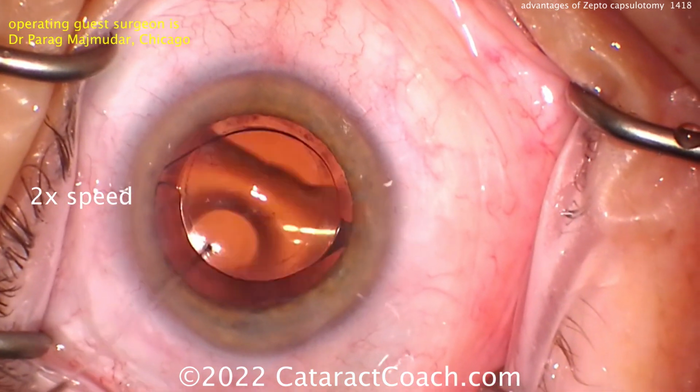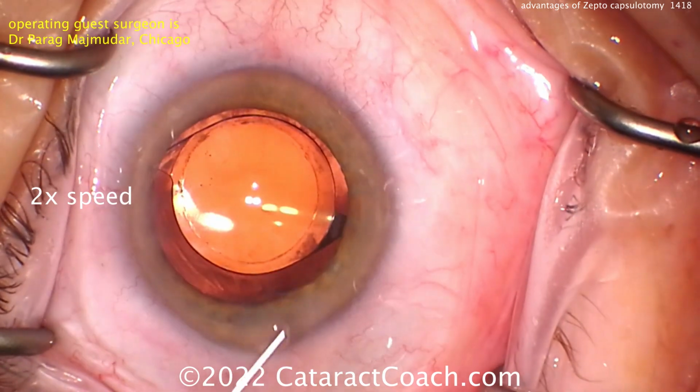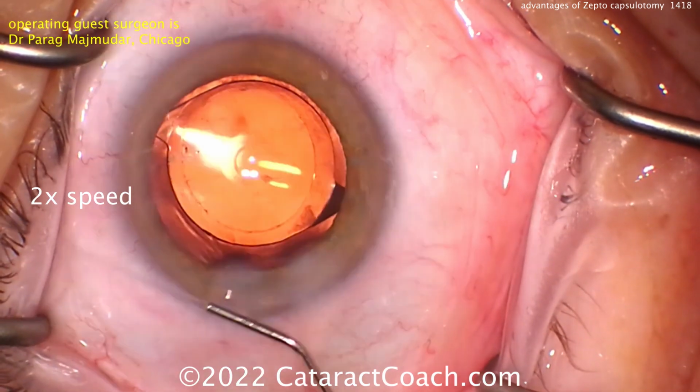You can tell, looks like that's an extended depth of focus lens. Looks like to be an Alcon Vivity lens. And you can see that central focusing element. And those Purkinje images are beautifully centered as well. And then just sealing up the incision here and calling this a day.